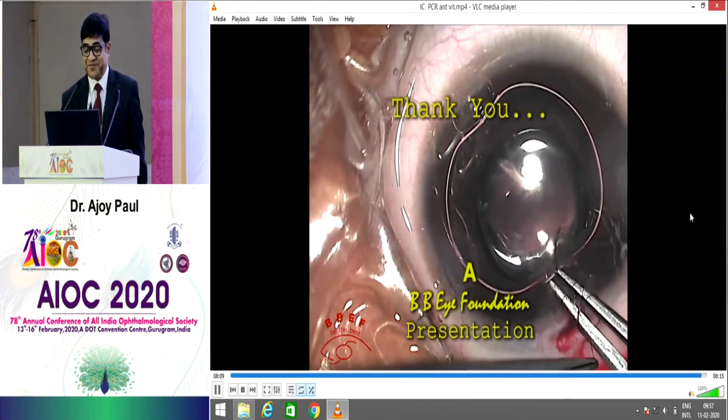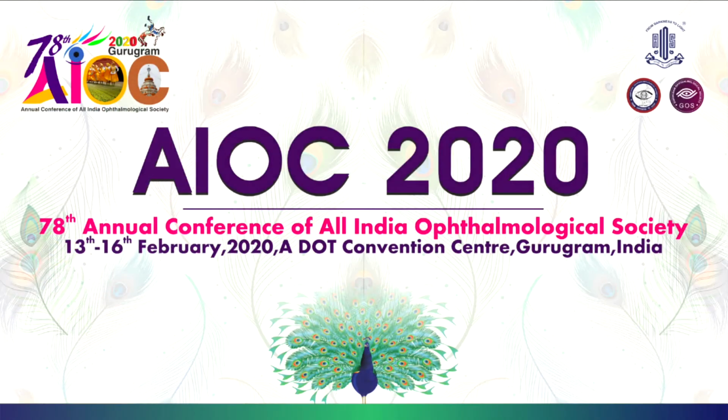Thank you, sir, for some lovely illustrative videos. Two or three key points that we must remember: we saw how the capsule got captured in the port. Remember, when you do capture the capsule, don't move the port around. You must be familiar with the reflux button. If you're using a new machine, the foot pedal gives you a reflux. So even if you've caught the capsule, you just don't pull on it or jerk suddenly; you can obviously reposit the capsule back without a PC rent.